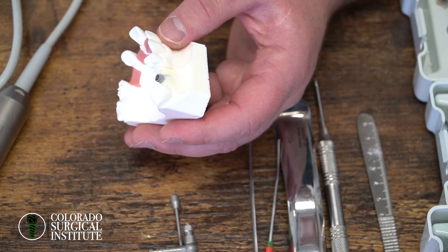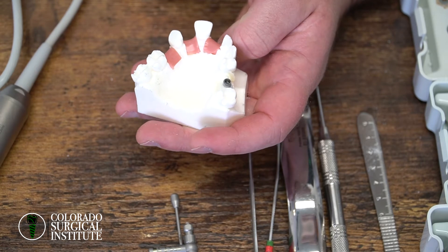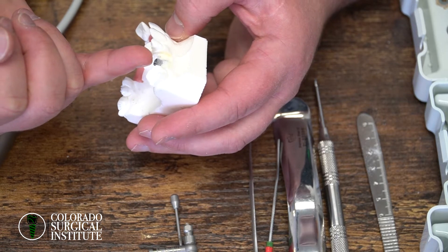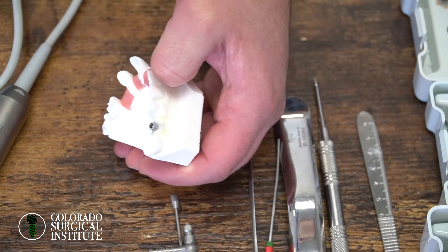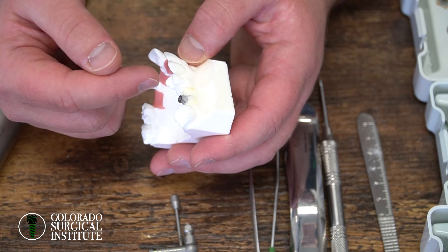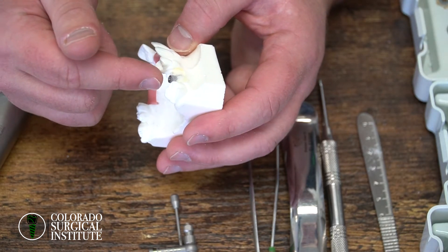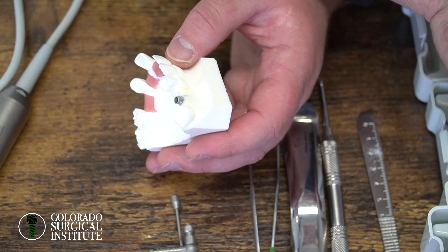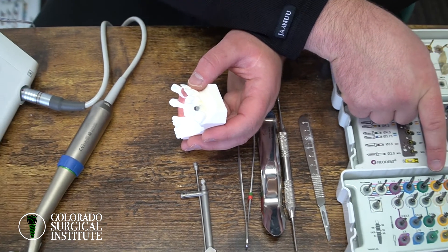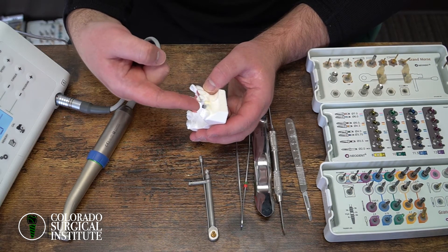Typically you're going to be drilling about a millimeter longer and usually a little bit wider. So let's say this is a posterior site and we have a 4.3 implant — a 4.3 by 11.5. You put it in and it's that stable. What I would do is put the 4.3×11 burr back in, bring it to a 4.3 by 13, then grab the plus-size burr to make it a little bit wider, and put the plus-size burr all the way to depth.